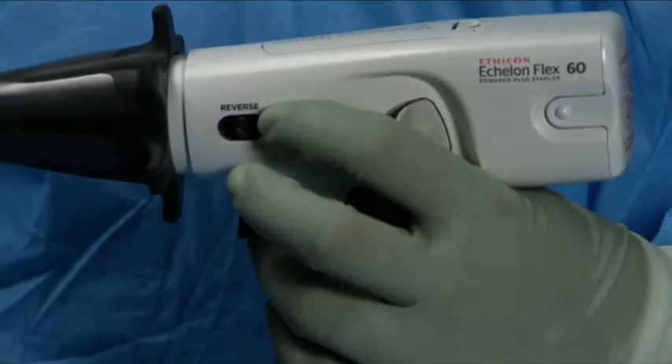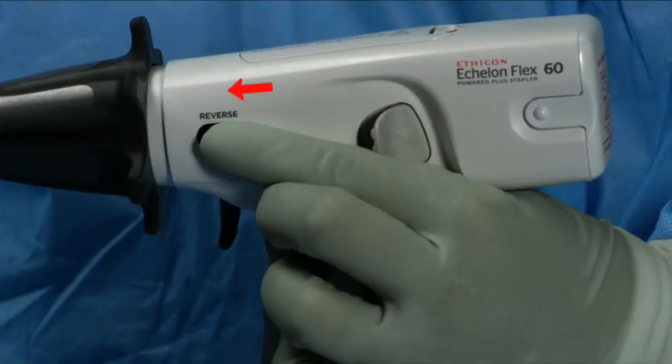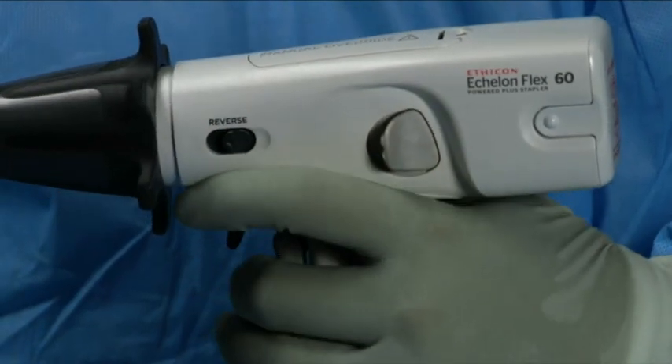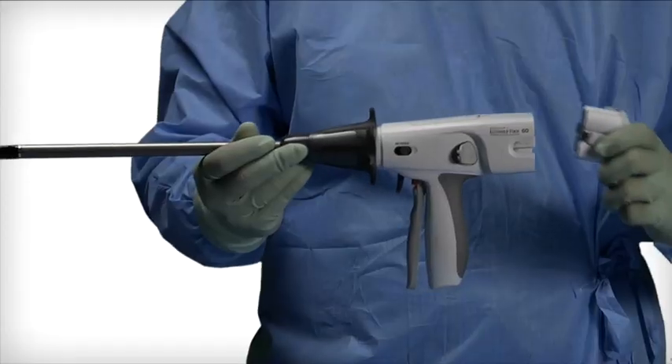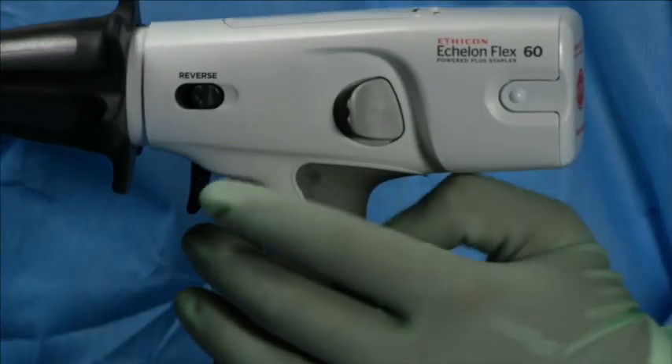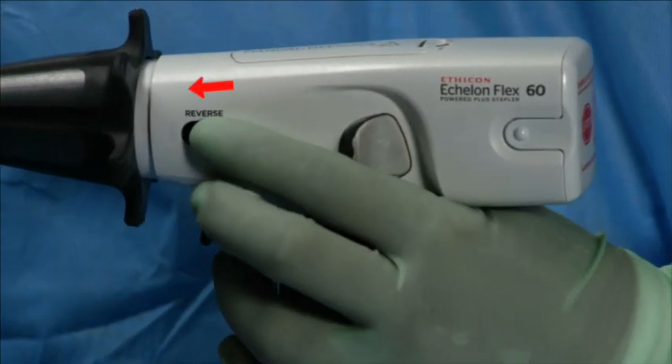If the knife reverse switch does not return the knife to the home position and the jaws do not open, first ensure the battery pack is securely installed and the instrument has power. Then try the knife reverse switch again. If the knife still does not return, use the manual override.